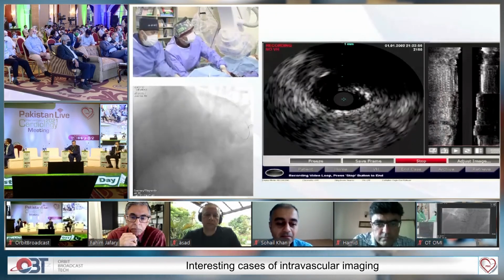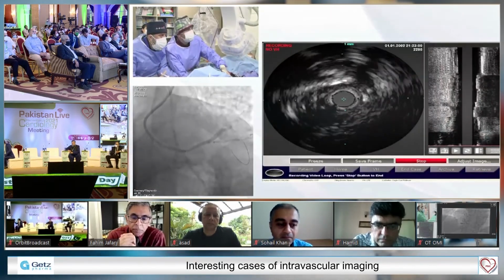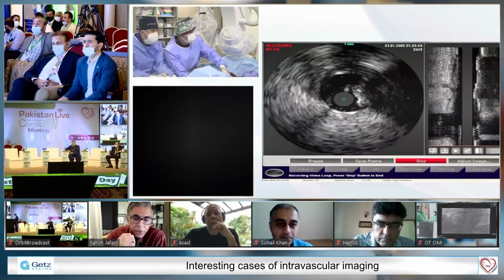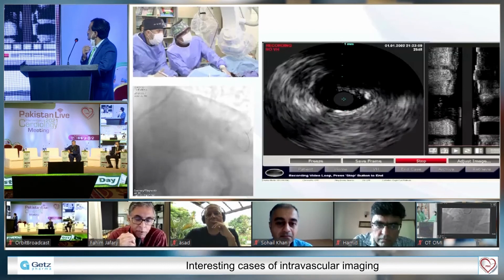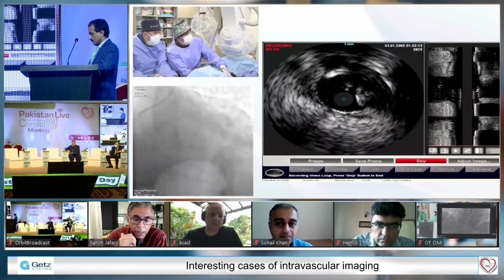I think the lumen doesn't look too bad, actually. It is almost more than 6 millimeters square, the lumen. I think the plaque burden is considerable in the proximal vessel. I mean, if you want to future-proof this intervention, I would lean towards stenting all the way back.